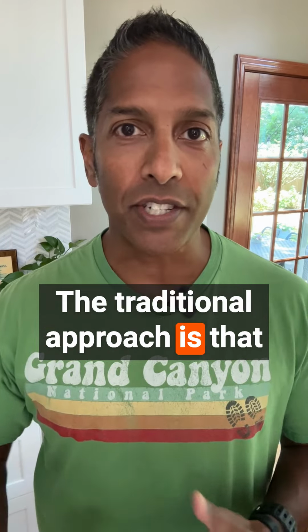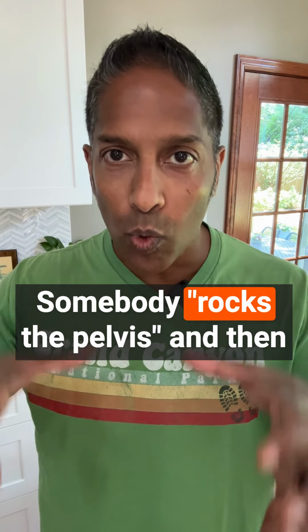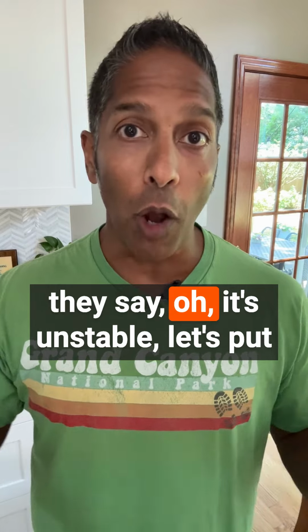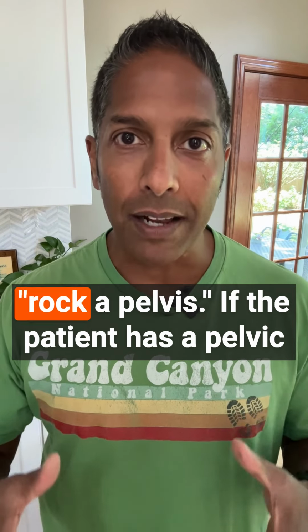The traditional approach is that you get the patient with blunt trauma, they've got some hemodynamic instability, somebody rocks the pelvis, and then they say, oh, it's unstable, let's put on a pelvic binder. The truth is that nobody should ever rock a pelvis.